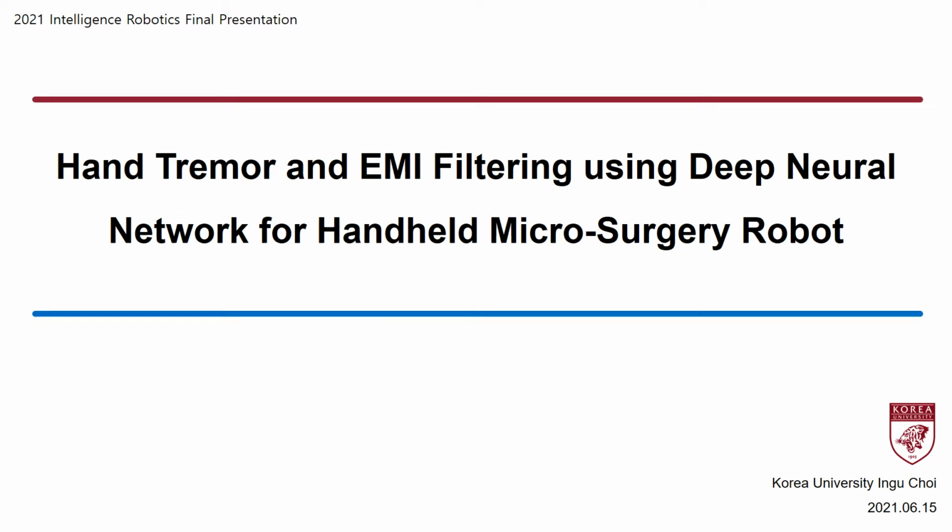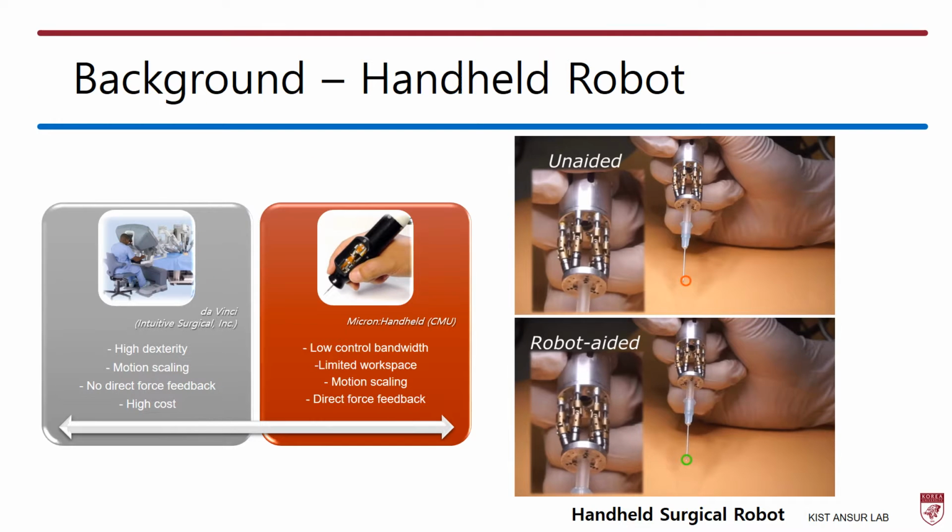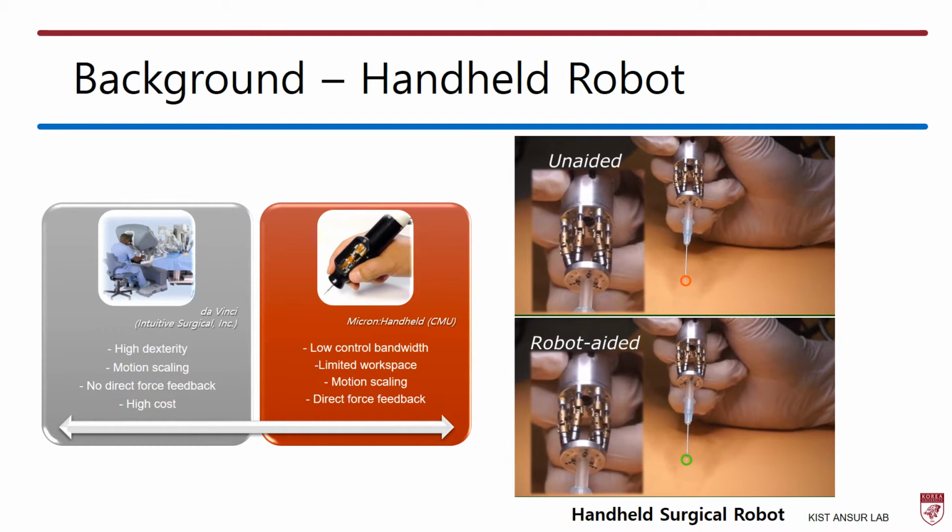Today, I talk about hand tremor and EMI filtering using a deep neural network for a handheld microsurgery robot. Before I start the presentation, I will explain the handheld surgical robot.